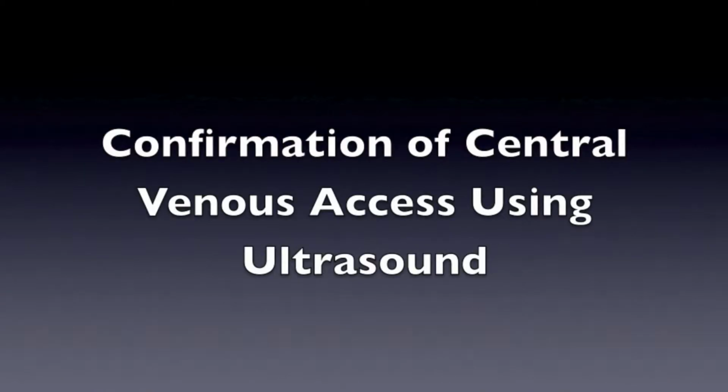This is a tutorial on how to use ultrasound to quickly determine whether you have venous placement or have caused a pneumothorax from your newly placed central line. This will allow you to begin using your central line moments after placing it rather than waiting for more finalized confirmation from a plain film.